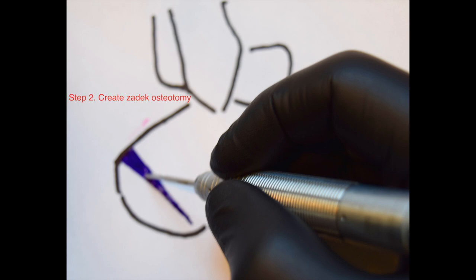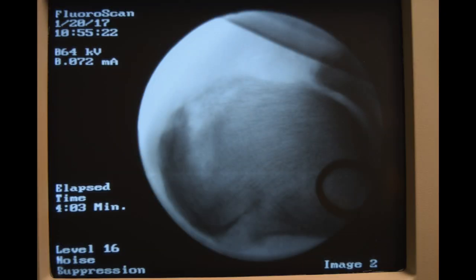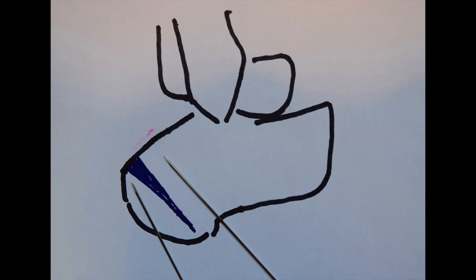The osteotomy is going to be made and feathered at the bottom and pushed anteriorly — you're basically pushing the heel forward. This is how the osteotomy looks on the fluoroscopy. Once that's done, you can push this osteotomy together by feathering it, or you can use K-wires through the heel and push it together by separating the K-wires. These can be placed before the osteotomy as well.